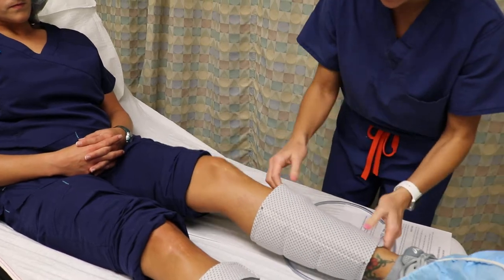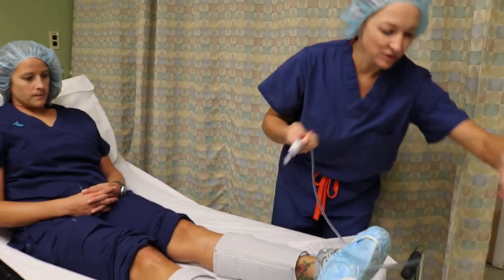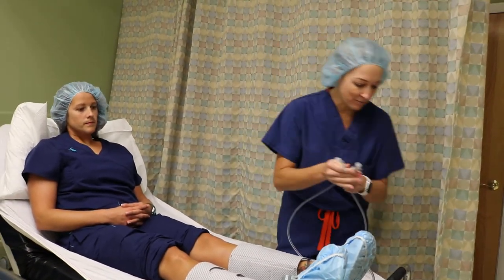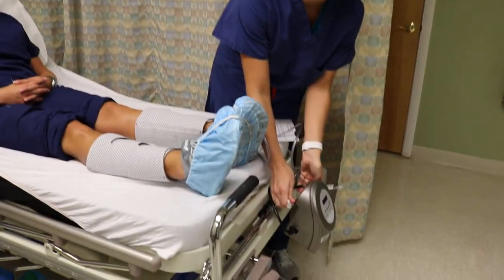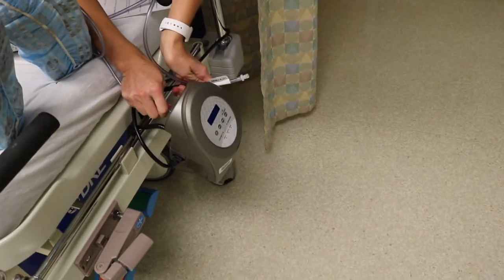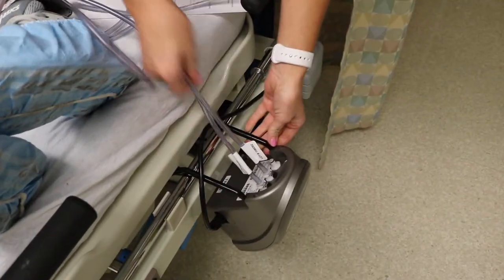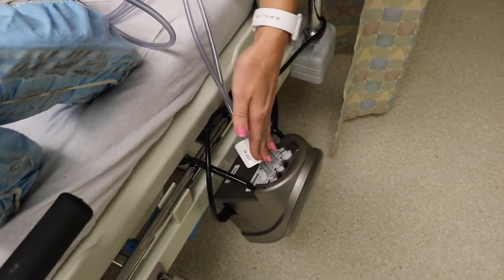Once we are set and hooked up and fitted well, we have two connectors here, one from each sequential. They then plug into the unit here that actually pumps up periodically to provide the circulation of blood flow in the legs. You simply hook the ports into the two attached ports — it does not matter which one goes into what port.